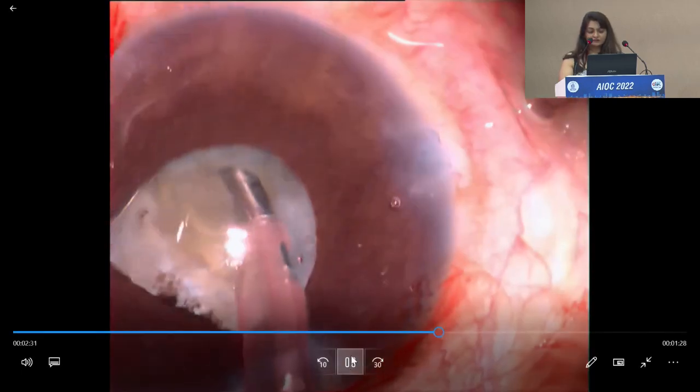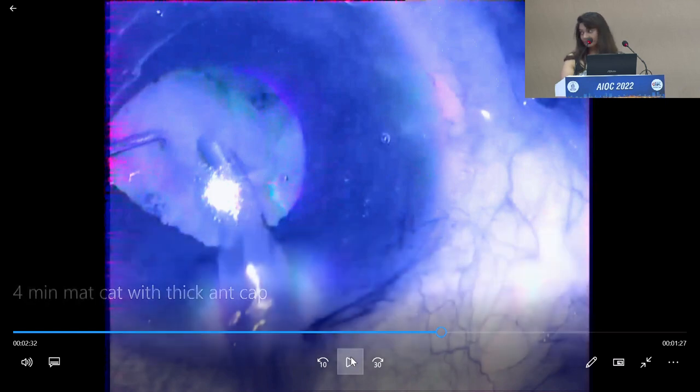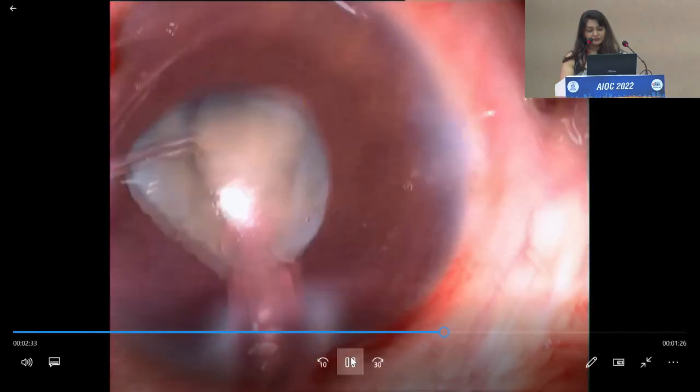Sheetal, don't you think that if you had used any pupillary expander devices, your life would have been very much easier? Yes, and that is what I generally do. But as I said, this was the case where, for that rexis, I must have spent an amazing amount of time coming and going out. And in the end I was just like, whatever has happened, let me go ahead. And now again, the pupil is coming down. Yes, it's absolutely true. I should have put the pupil expander.